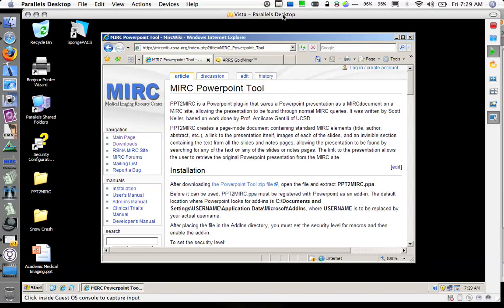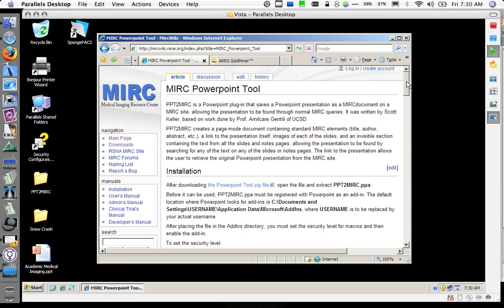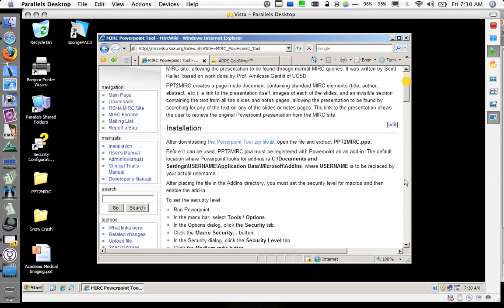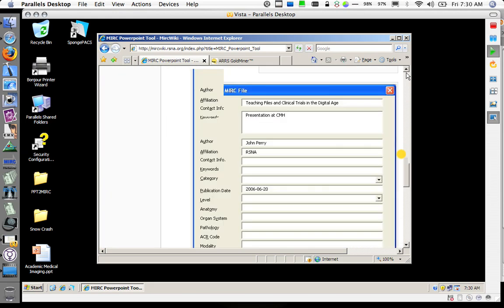Hi everybody, my name is Ron Sweeney and I want to give you a quick screencast of how to use the MIRC PowerPoint tool. As you can see here, the MIRC PowerPoint tool is very well documented on the MIRC Wiki.